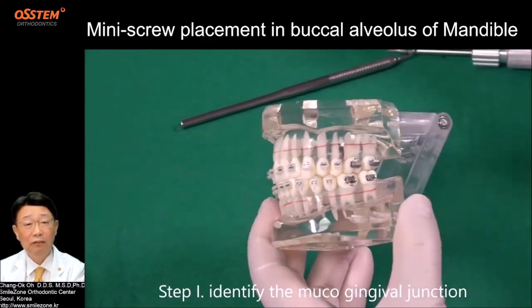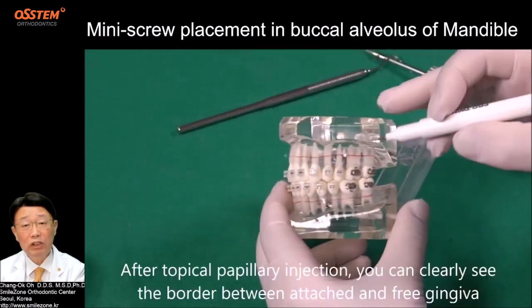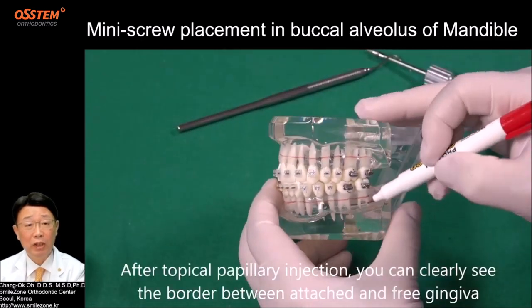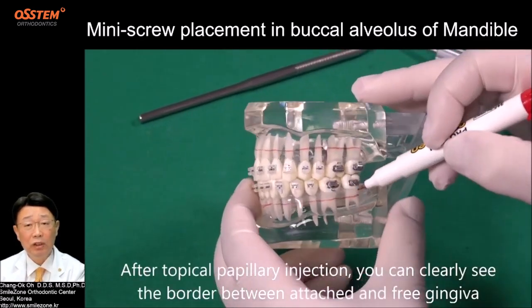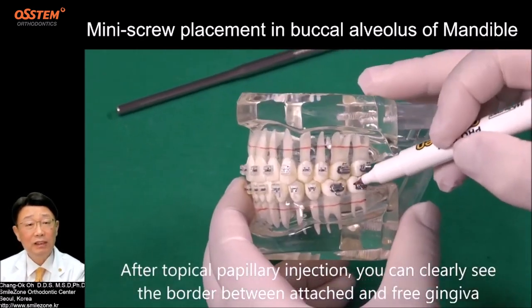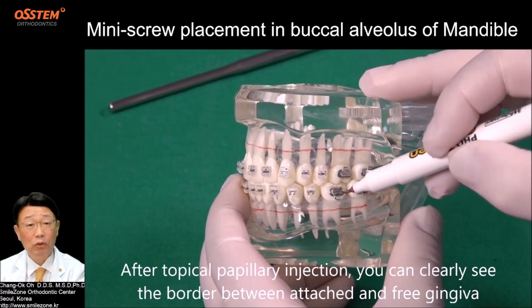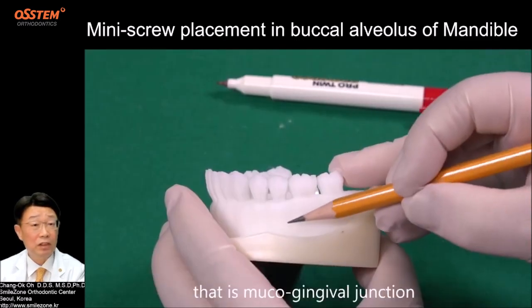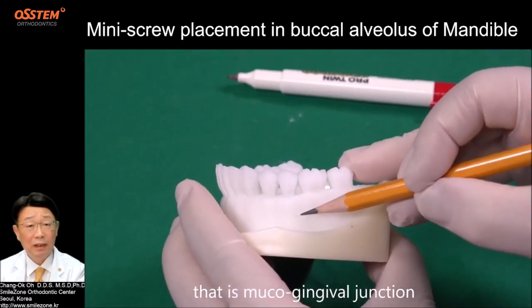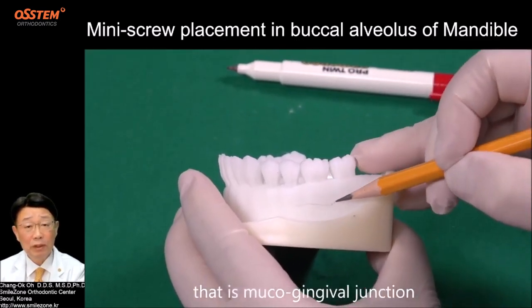Step 1: Identify the mucogingival junction. After topical and papillary injection, you can clearly see the border between the attached and free gingiva. That is the mucogingival junction.